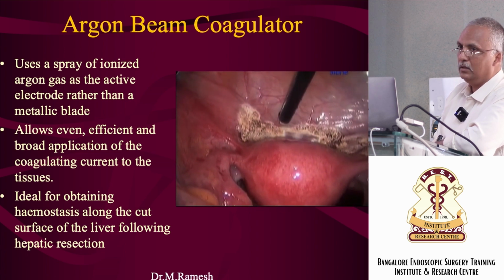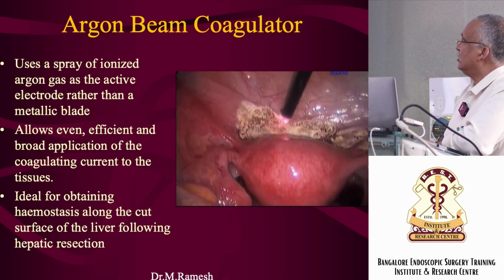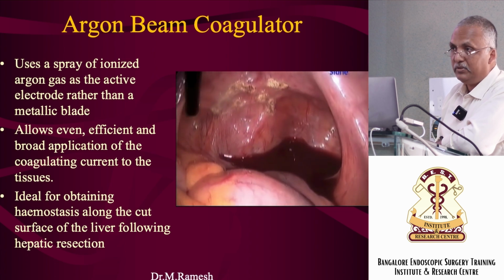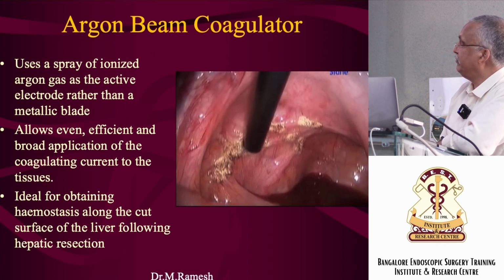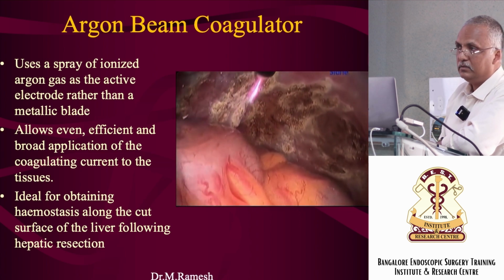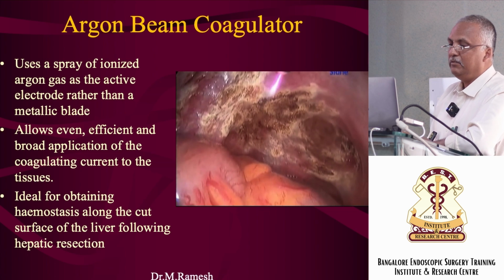See, this is a spray. You are just spraying it. You are on the urinary bladder, but you are spraying as a superficial coagulation. It does not enter the bladder. Okay, you are on the UV fold. There is a lot of endometriosis there, and you can just use it safely. Okay, give it to a child. You see what it can do.